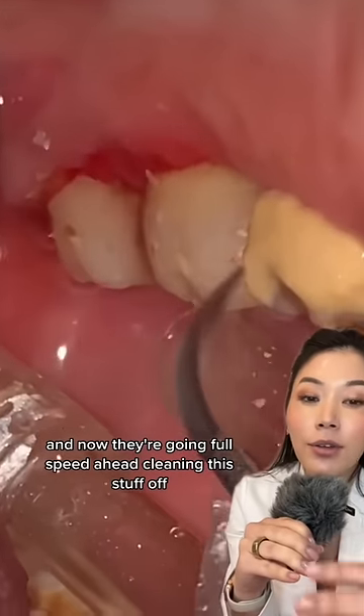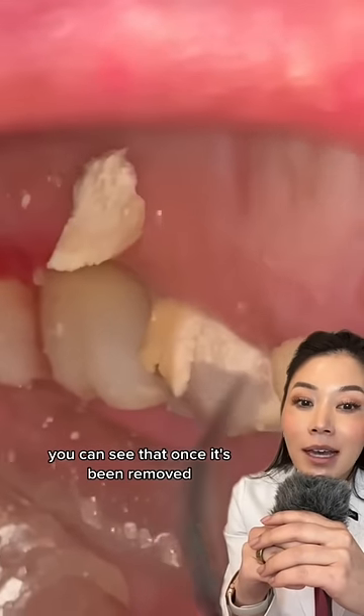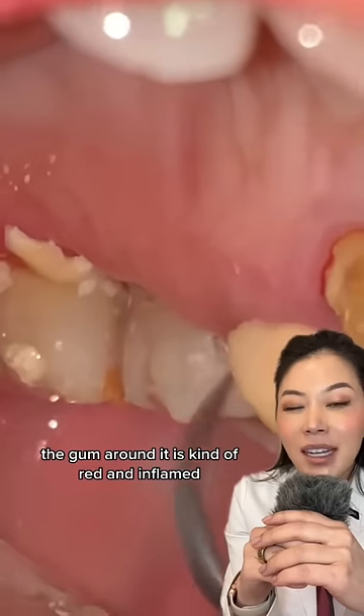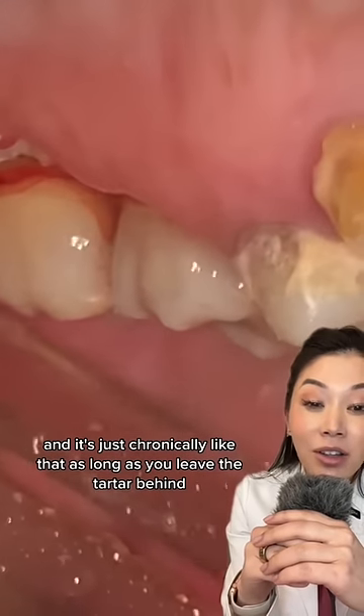Now they're going full speed ahead cleaning this stuff off. You can see that once it's been removed, the gum around it is kind of red and inflamed — it's just chronically like that as long as you leave the tartar behind.